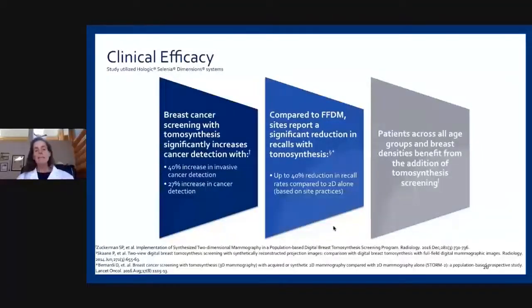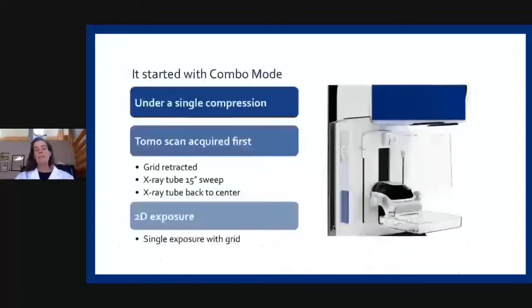And the nice thing about tomosynthesis is that across all breast densities and age groups, it does better. And so some of us who went through the digital transition, initially we were focusing more on the dense patients, but we know tomosynthesis does better in all breast densities, which is, again, I think really something that we need to recognize.